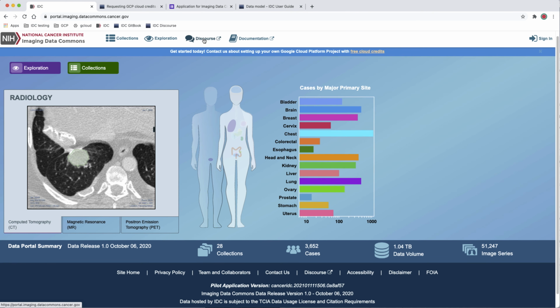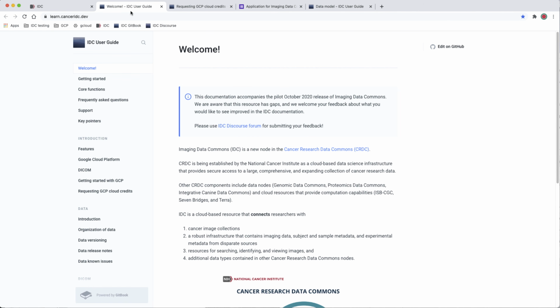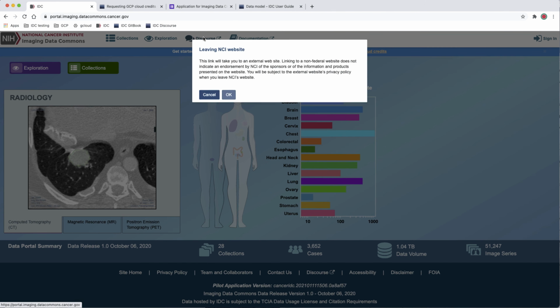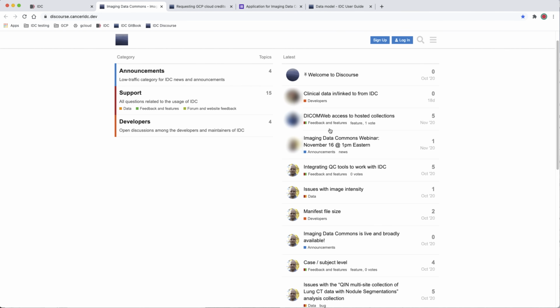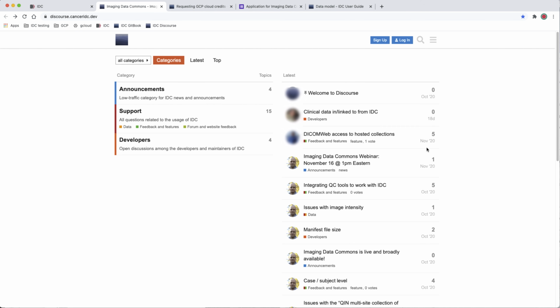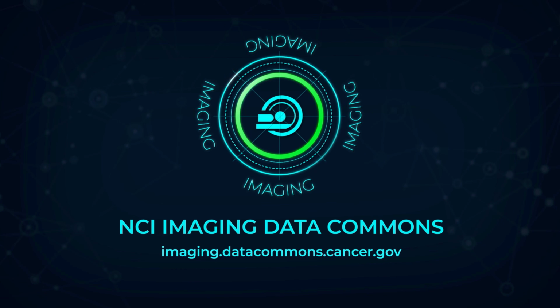To learn more about IDC, please check out our documentation and join our user forum to ask questions and find help from the developers and maintainers of IDC. The forum is monitored by IDC developers who will promptly respond to your inquiries. If you have any further questions, please visit the IDC portal for the pointers to documentation and user forum.